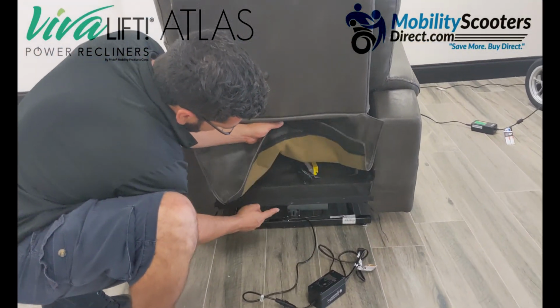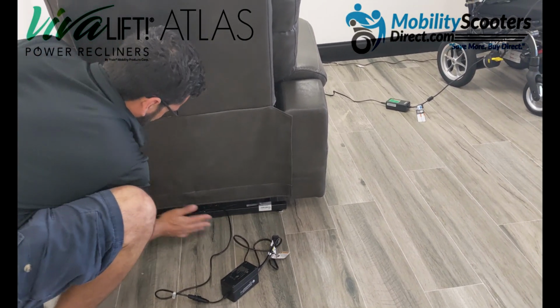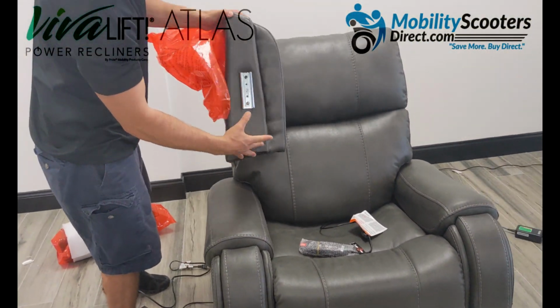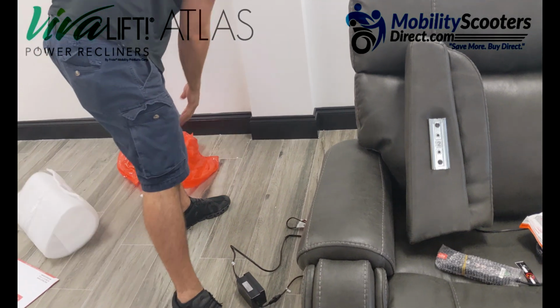After this, you can just find the flap on the back. It does have double-sided Velcro, which is just basically used to cover up all the wire harnesses and the back part of the chair where you can gain access to do the assembly. Now all we have really left to do is attach the side pieces here. There are 2 of them, and they're very easy to install.